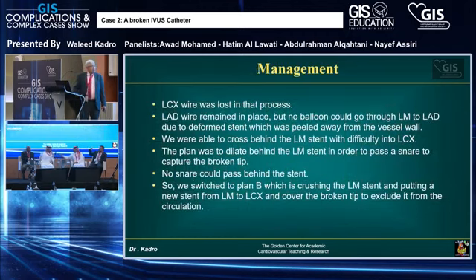Is there a stent in the left main or no? There is a stent in the left main. And you crossed through the struts of this stent? Yeah. But you didn't dilate the struts from left main to CX? No. I showed you I did POT in the left main, but you did not open the struts. No, the IVUS catheter just went through the normal struts without dilating. Yeah, I just went from the stent to the circ and did the IVUS. Do you have any comments, or can we ask if the audience has any? No, let's go on.